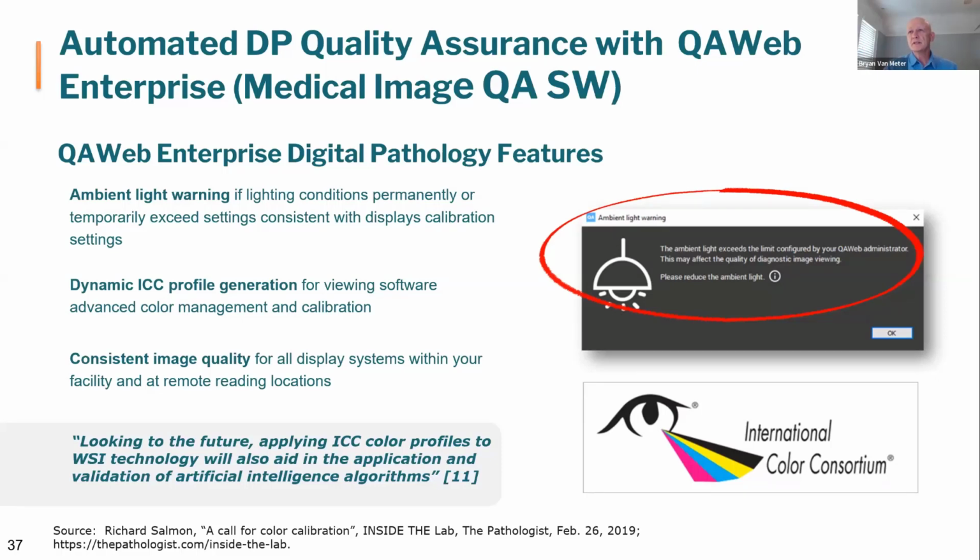The other thing that Tom mentioned is the International Color Consortium. It's a topic all unto itself, but think of it this way. Any device that reproduces color can, through the International Color Consortium and ICC profile generation, be characterized. It says, hey, I'm a device, this is how I see color. That can be quantified and provided over to the operating system.